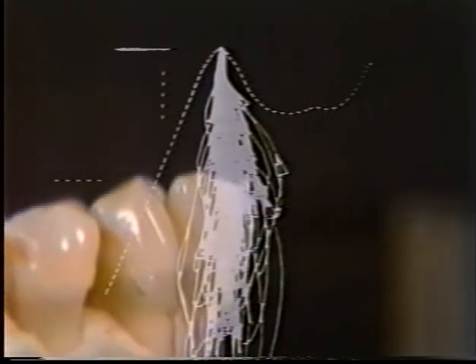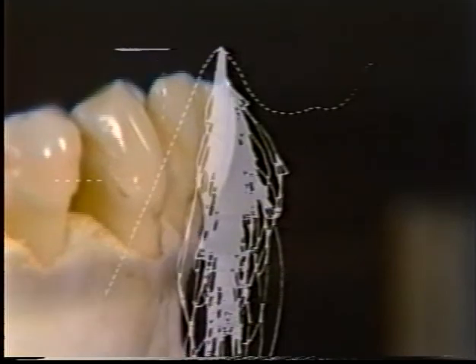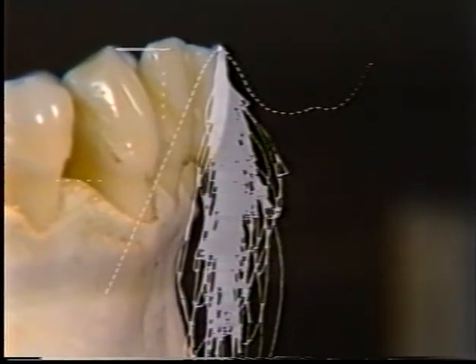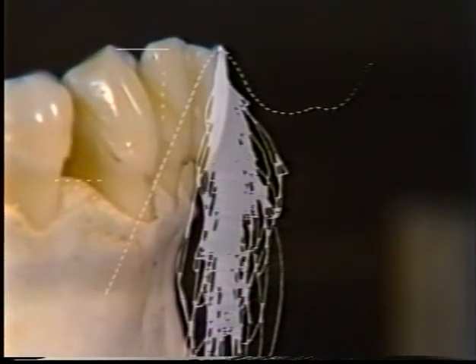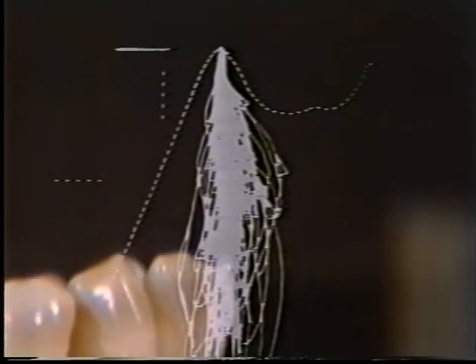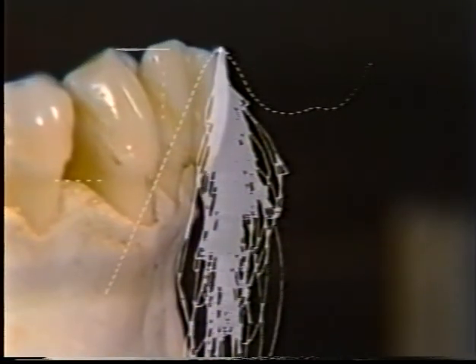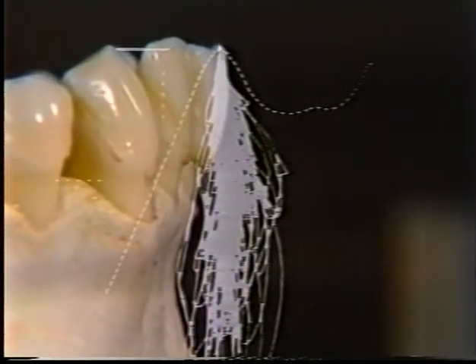Show the character of the final closing tracings as the teeth reach their intercuspal position. The incisor point can be seen thrusting forward during opening. This could be expected knowing that both condyles translate forward immediately and simultaneously during the opening phase of chewing. The incisor point closing strokes follow posterior to the opening strokes.